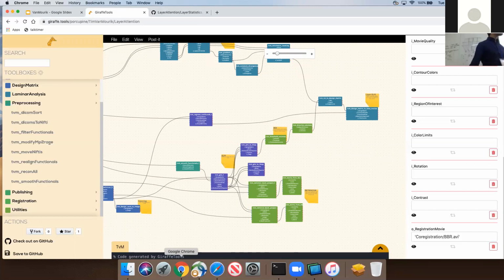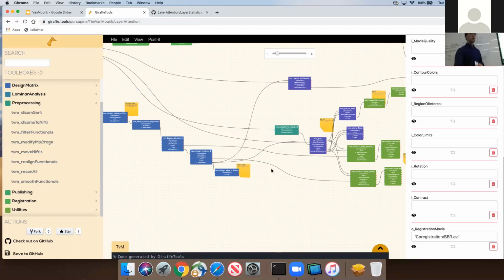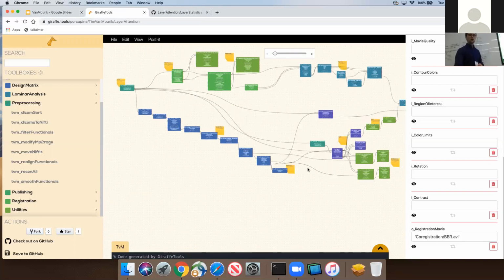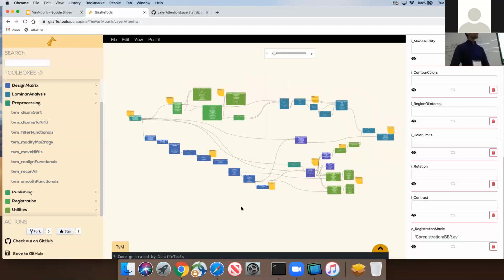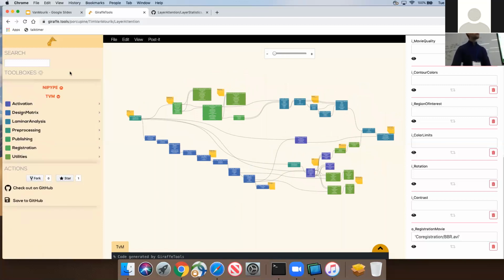I would like to see, now you have here the interface, I understand that the subject folder is basically the same version of that. Right, it's a very good question. In preparation for the presentation, I decided not to go too much into the application because we wanted to talk about layers. But if you're asking, I'm at least curious to see how this runs, and whether the different tools are working happily together or not.